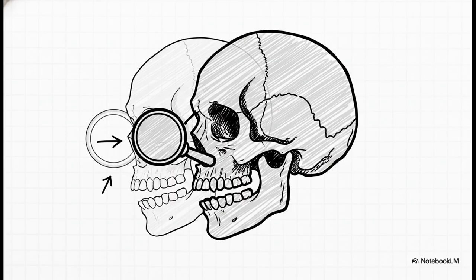For a lateral skull to be evaluated as perfectly successful, the magic word is superimposed. You must see perfectly superimposed orbital roofs and greater wings of the sphenoid. The left and right mastoid regions and external acoustic meatuses, perfectly overlaid. The left and right temporomandibular joints, your jaw joints, they must be superimposed. And beautifully, the sella turcica, which is the saddle-shaped depression in the skull base, must be perfectly in profile. If all these match up, your geometry was absolutely flawless.